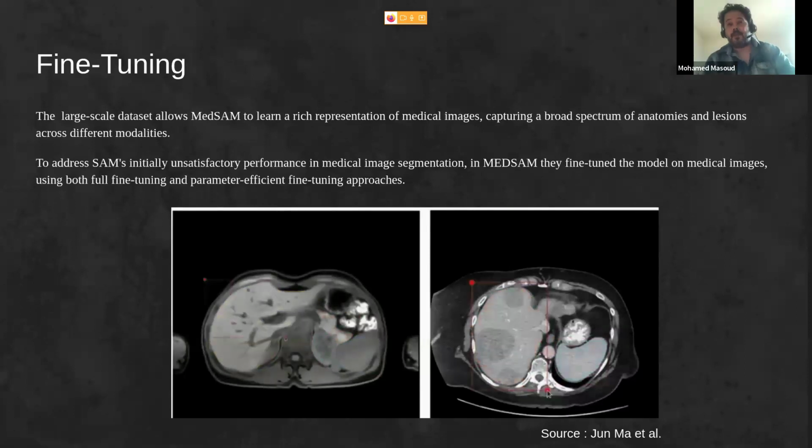They actually implement that. They have a public repo on GitHub showing exactly the same results. So the code is available, and these are the results they get. I believe this is the liver part, and they have 3 different approaches. I looked at it late yesterday, so I didn't go through all the code, but you can do that even in text mode. You can tell the model, give me this part specifically.